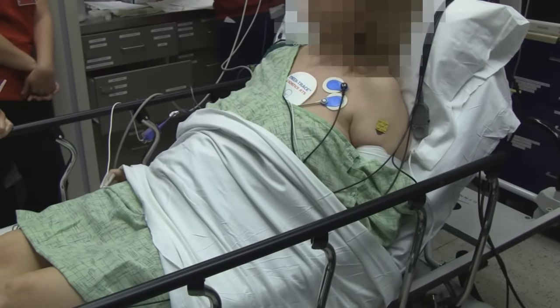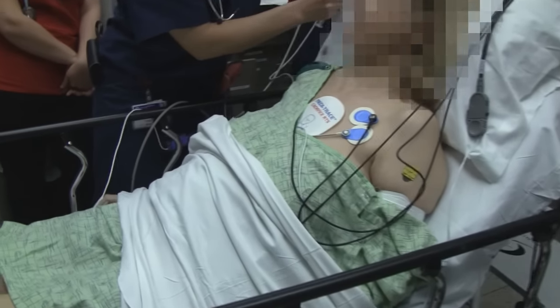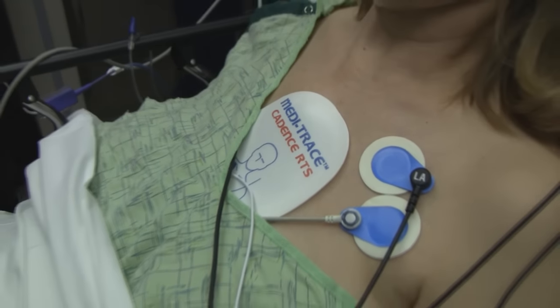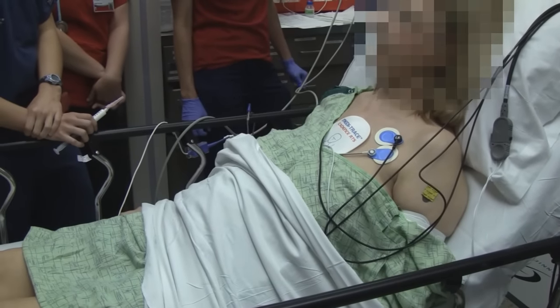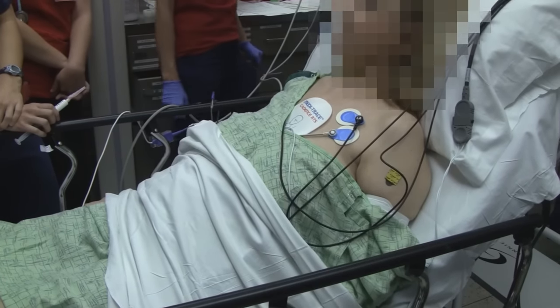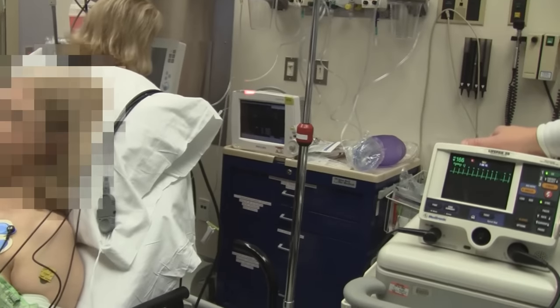How do you put your pads on? Is this anterior-posterior? This is a typical anterior-posterior location. Occasionally we'll do side-to-side. That tends to work best? It depends on the body habitus, but for someone with her type of body habitus, this is a very acceptable pad location. Suction's ready. Airway equipment's ready.